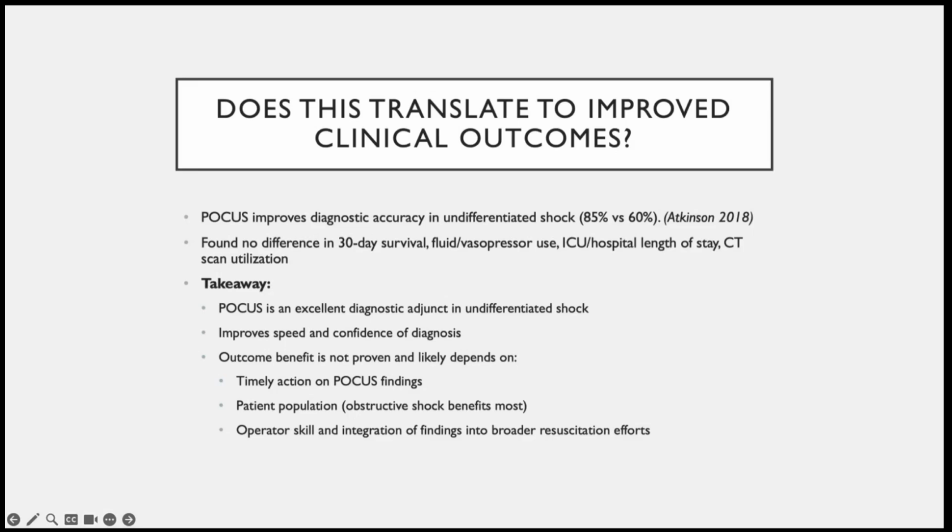The outcome benefit is not proven, but it likely depends on multiple other factors, like timely action on your POCUS findings. And maybe it's just a certain patient population that benefits most, like our patients with obstructive shock and evidence of tamponade. And again, operator skill and integration of your findings into your plan and resuscitation efforts likely contribute as well.